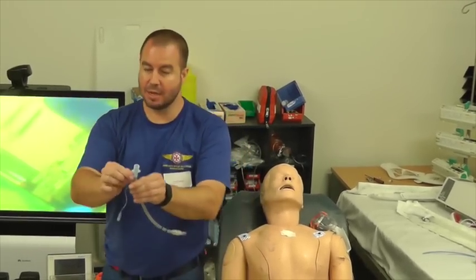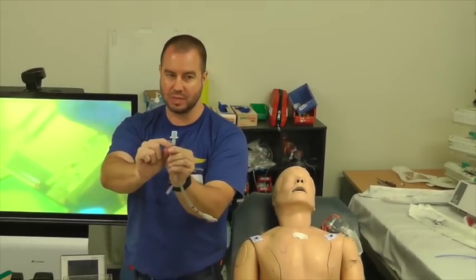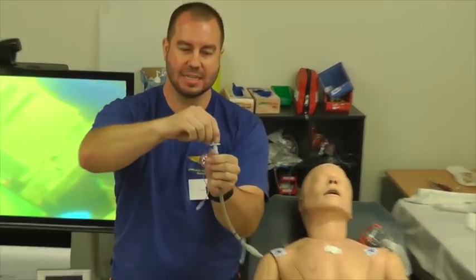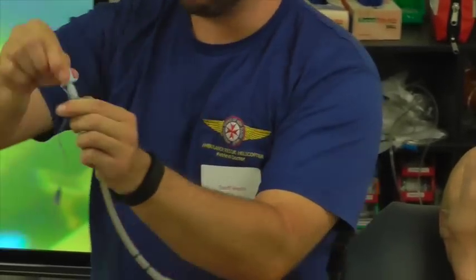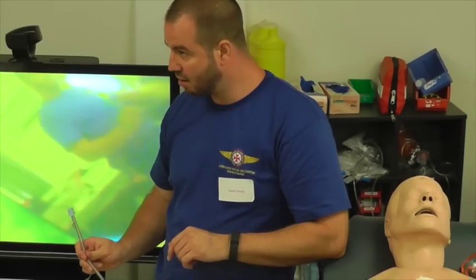The next thing is, when they come in their packets, the metal ring often has a little bit of a gap between the blue cap, and they are easily able to be kinked, especially when they're warm. So just be mindful of that. Is everyone cool with that?